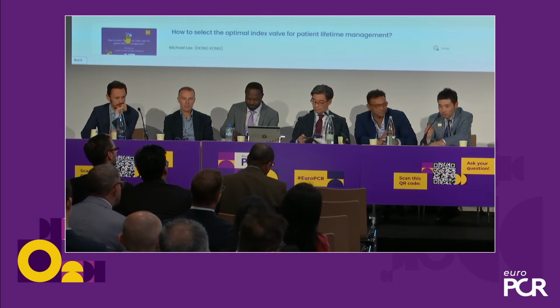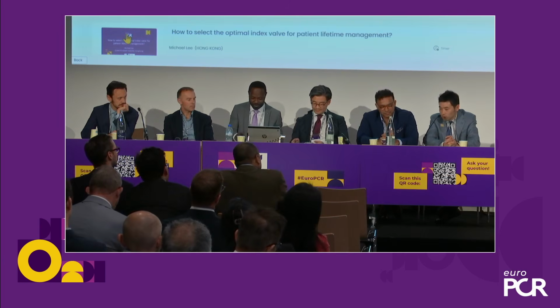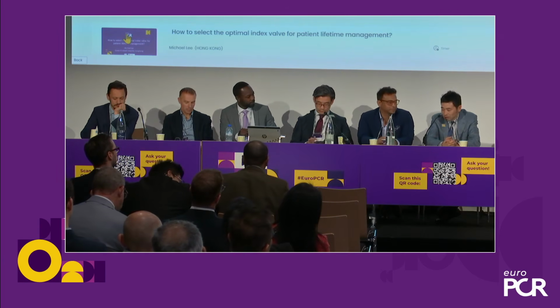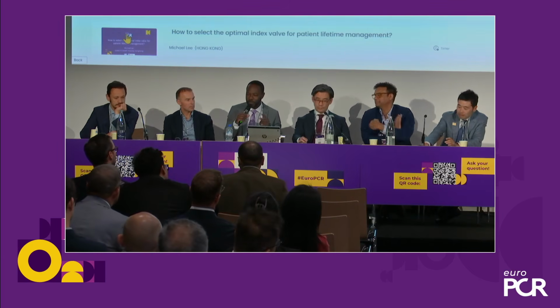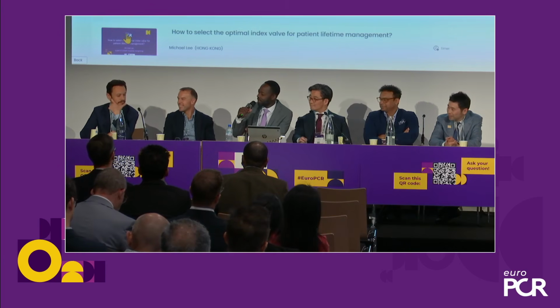Well, that's a good point, but it may impact the hemodynamics if we go significantly low. So the bottom line is I should aim for like 4 or 5, but not too deep. Yeah. And one final question to you, Maurizio, because you're a surgeon here.